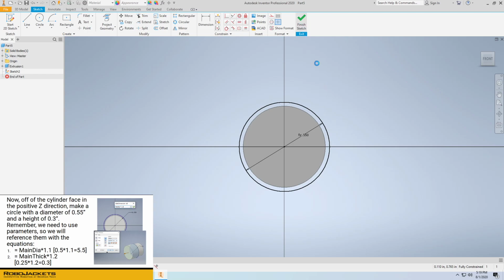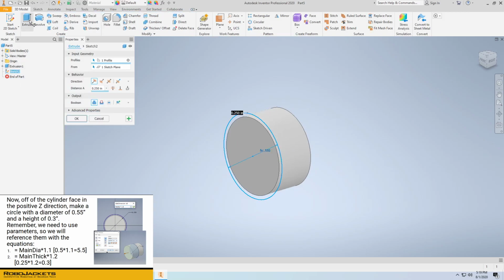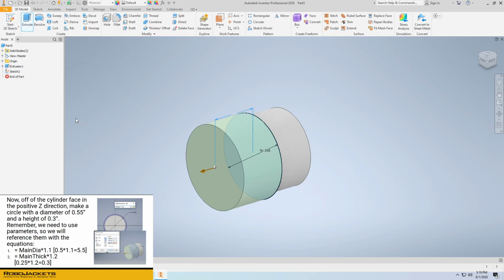Go ahead and finish the sketch up. Now grabbing this guy and extruding it. We're not going to give it a real value. We'll instead say it's main thick times 1.2. And get rid of the inches. There we go. And once again, changing main thick will change the thickness of the first feature as well as the second feature.